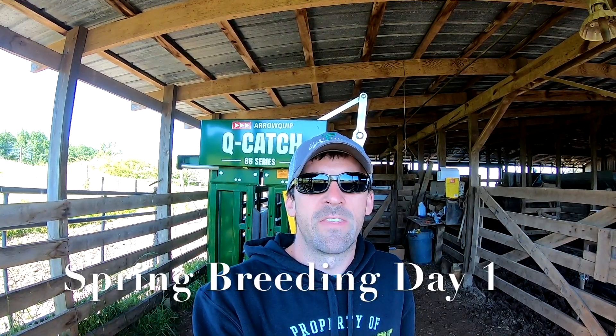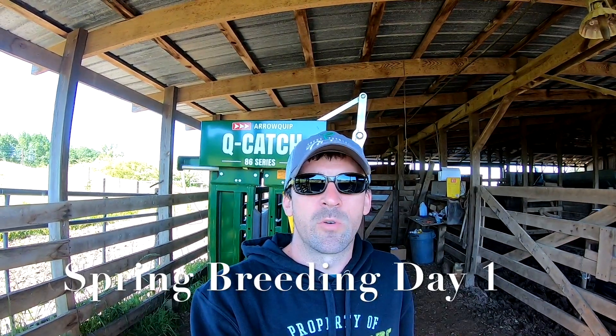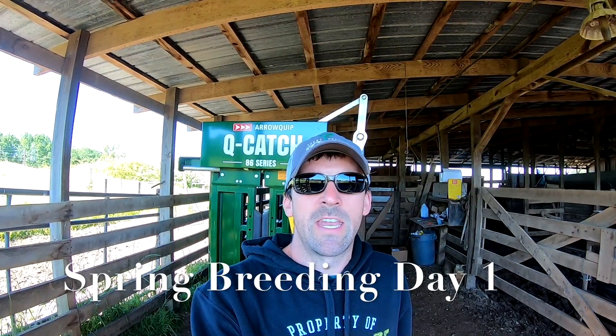So we're going to go ahead and get these heifers caught, run them to the squeeze chute, put the CIDR in, give them a shot, and get the breeding process started.